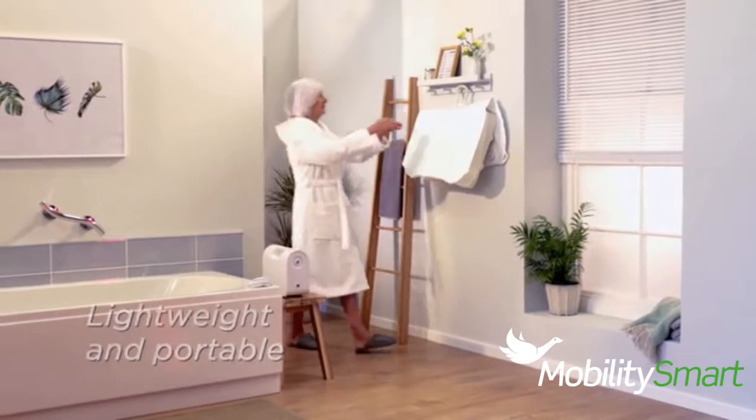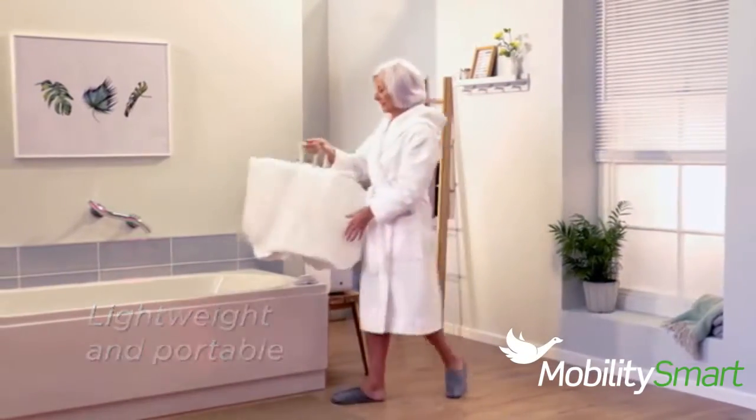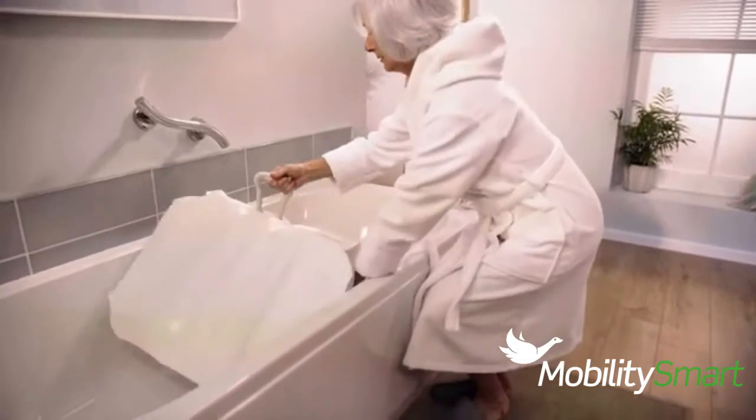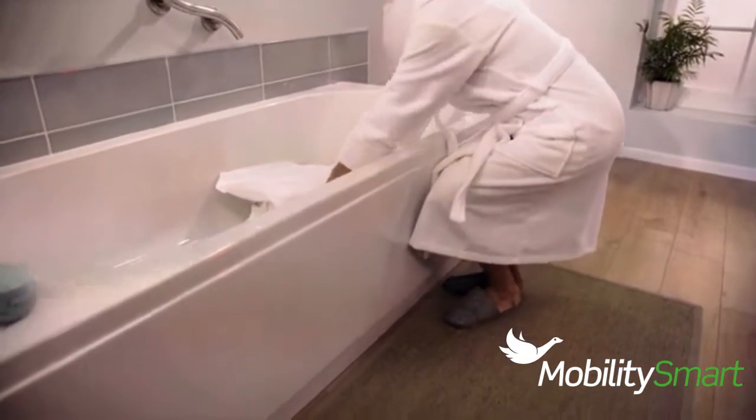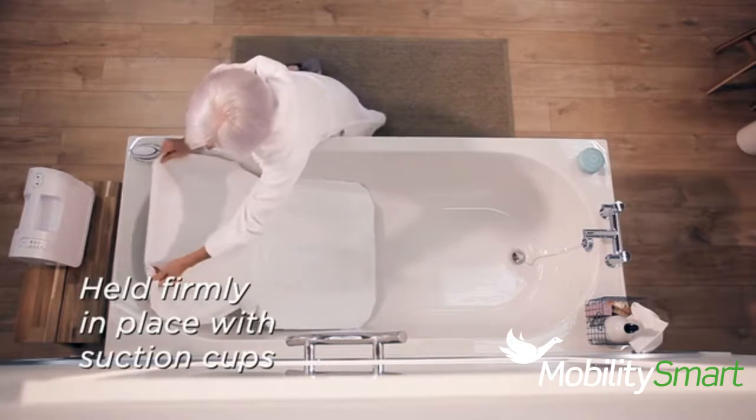The Bath Lift helps you get in and out of the bath independently in your own home. It's portable, lightweight and folds flat, so it can be easily stored away. The Bath Lift can be used with all standard baths, so there's no need for bathroom alterations.